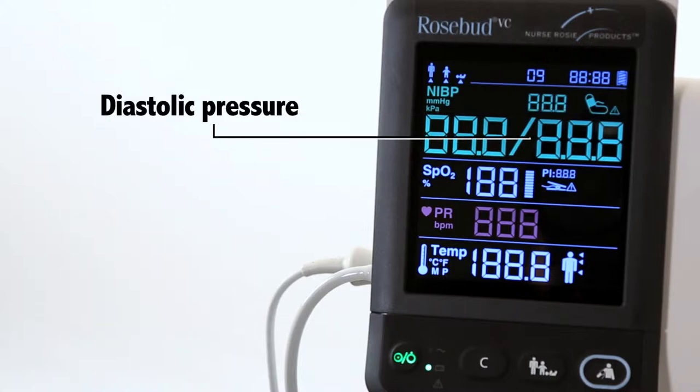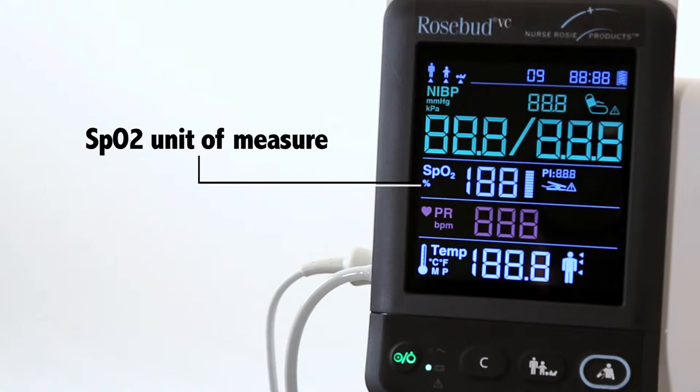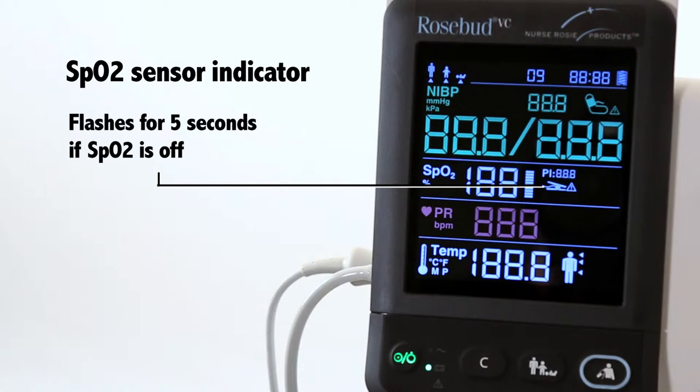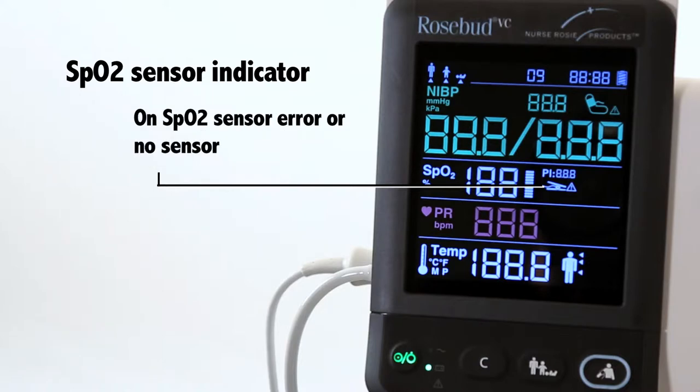Additional display elements include diastolic pressure, SpO2 label, SpO2 unit of measure, and SpO2 value. The SpO2 sensor indicator flashes for 5 seconds if SpO2 is off, persistently flashes if there is a weak SpO2 signal, no pulse, or too much light, and displays on SpO2 sensor error or no sensor.